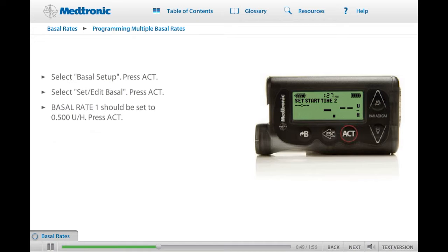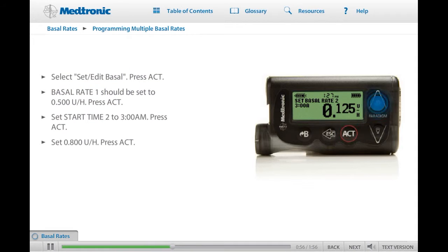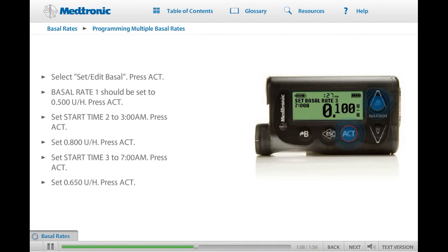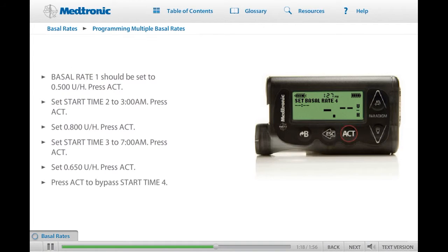Set Start Time 2 to 3 a.m. and set the rate to 0.800 units per hour. Press ACT to continue. Next, set Start Time 3 to 7 a.m. and set the rate to 0.650 units per hour. Press ACT to confirm. When the dashes for Start Time 4 appear, press ACT. We will only set three basal rates for this practice.